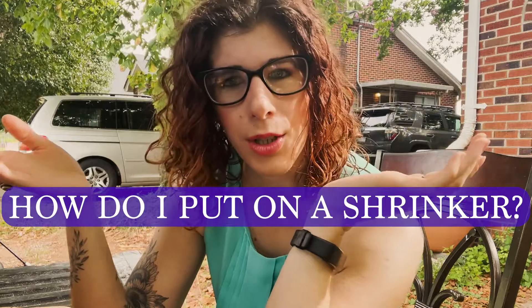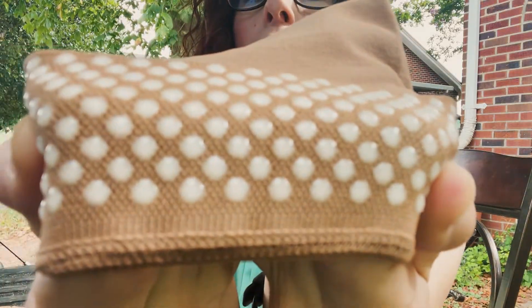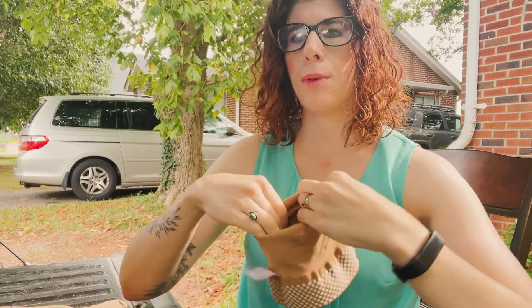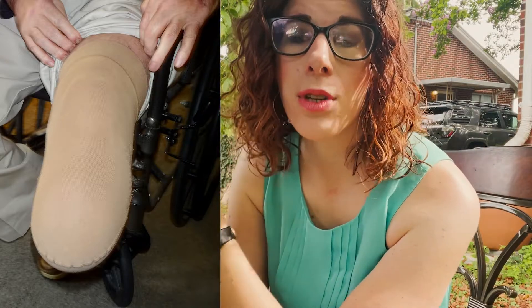How to put on a shrinker: when teaching patients, family, or caregivers, this is the one we use for transtibial below-knee amputees — it has some silicone beads to help it stay on the limb so it doesn't slide off. I typically instruct them to roll it down partway, stretch it wide, place it on the bottom, then roll up the top portion, making sure there are no wrinkles or creases. The above-knee transfemoral shrinkers are a little different — this one has a waist belt that goes around to prevent it from sliding down.